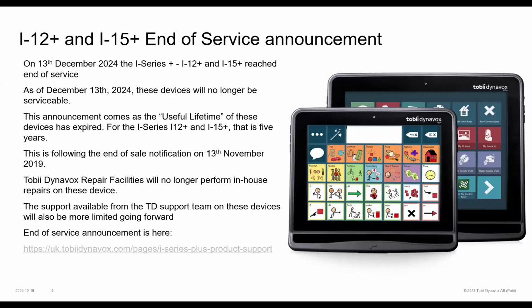Okay. In terms of news, I do want to spend a little bit of time on this very important piece of news, and that's the fact that the i12 Plus and the i15 Plus, the I series devices, have reached end of service. As of December 13th, 2024, these devices are no longer serviceable.